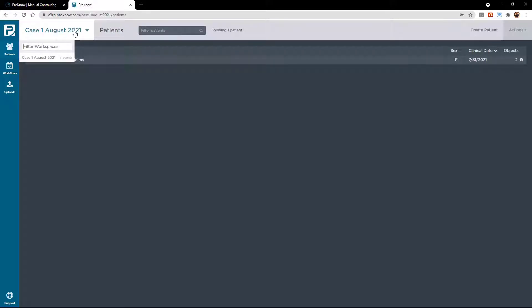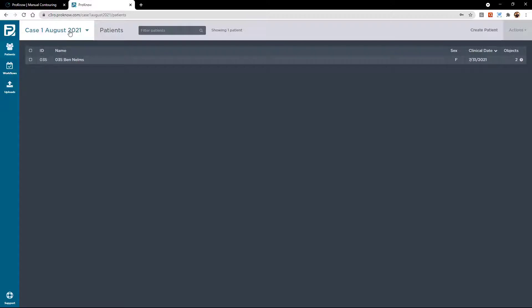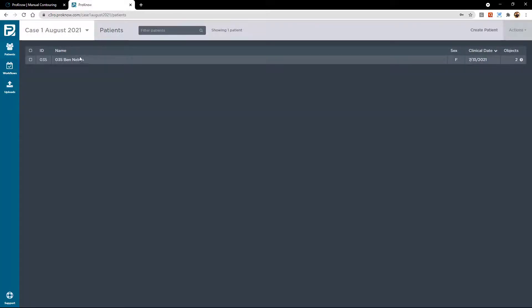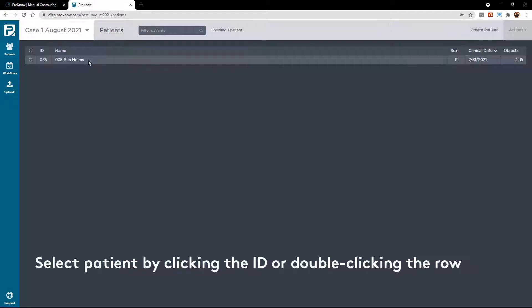We're going to create a new workspace for each case or for each new event. For the very first time, you'll only have one workspace — it'll be called Case 1, August 2021. When you select that, which will be the default, you'll see the patient that has been assigned to you, and you're ready to go in, highlight that patient, and start drawing contours. To select a patient, you can either double-click that row or you can single-click the ID.